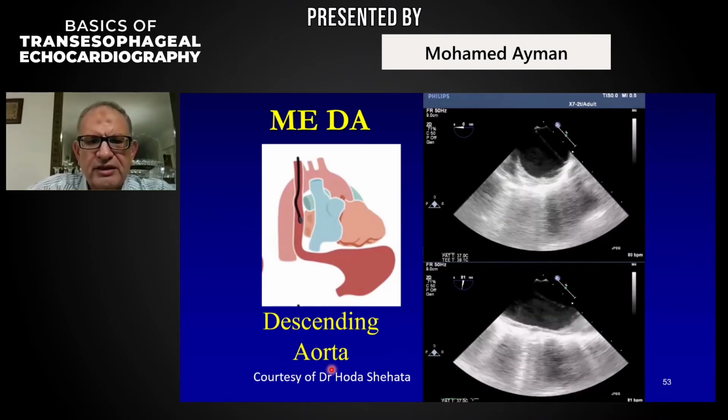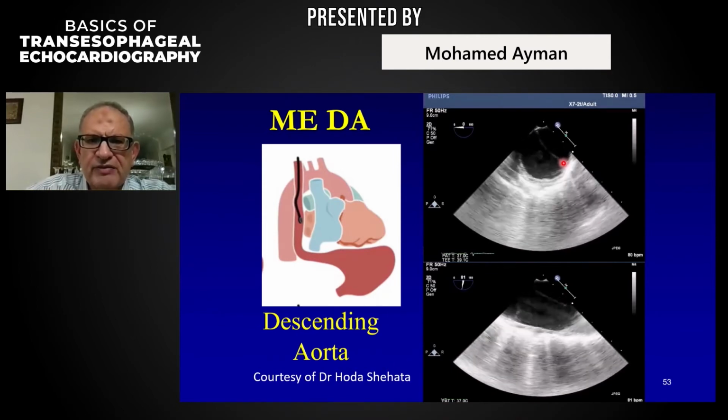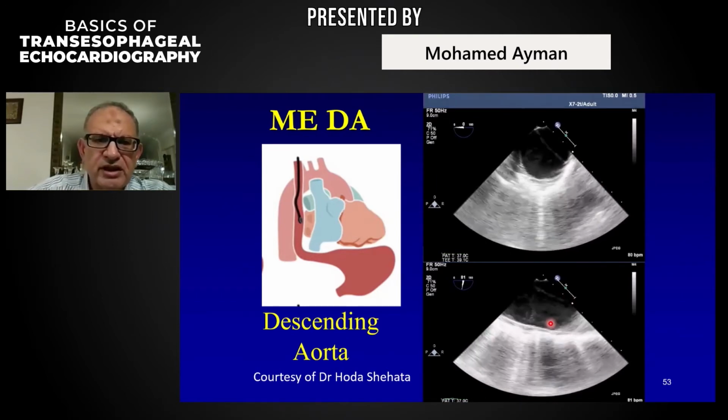This is video work of my colleague, Dr. Huda Shahata, in our echo lab here in Alexandria. And this patient actually has an intimal flap here. And this is the false lumen and true lumen in a patient with aortic dissection.